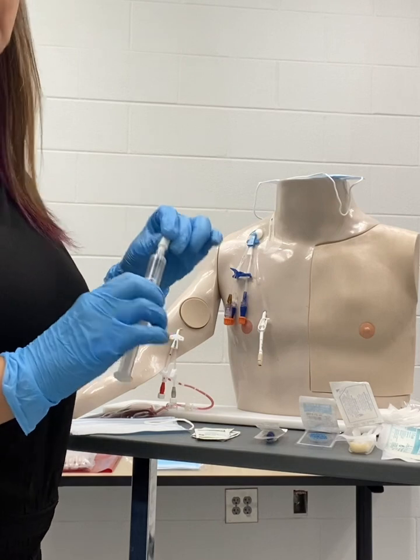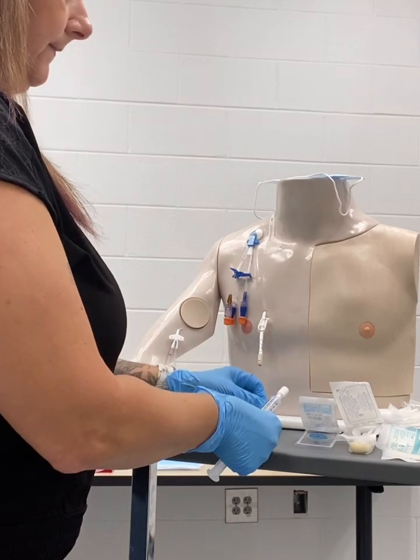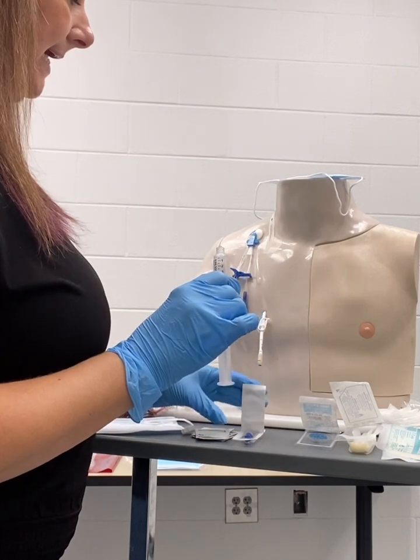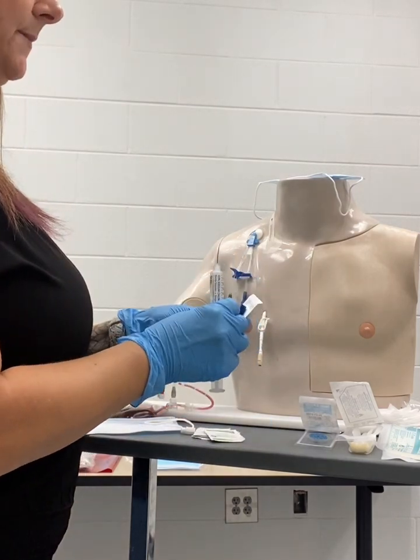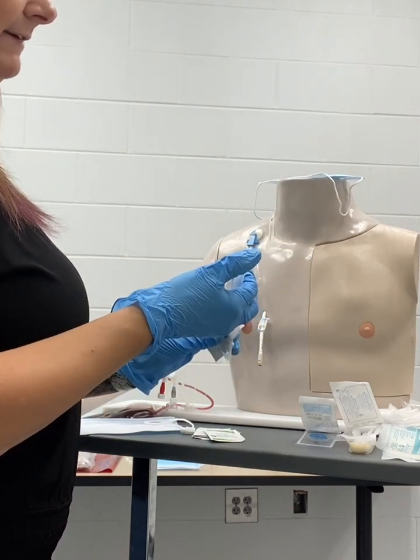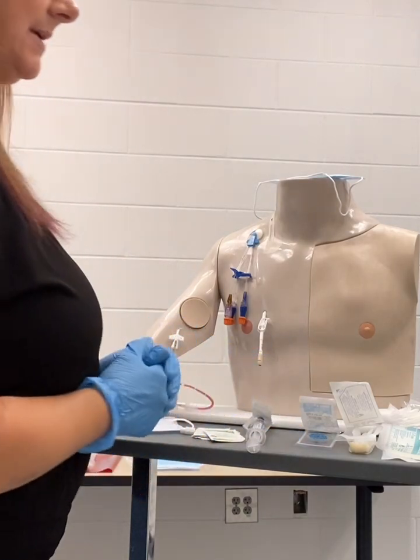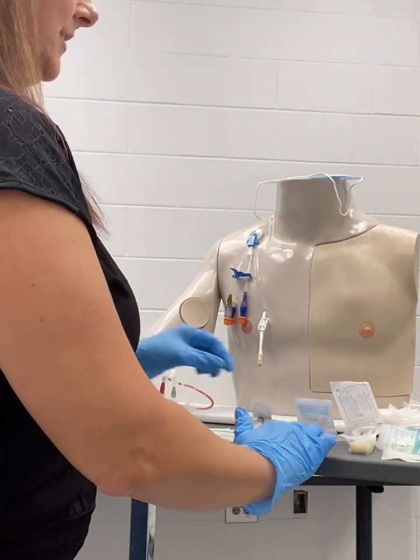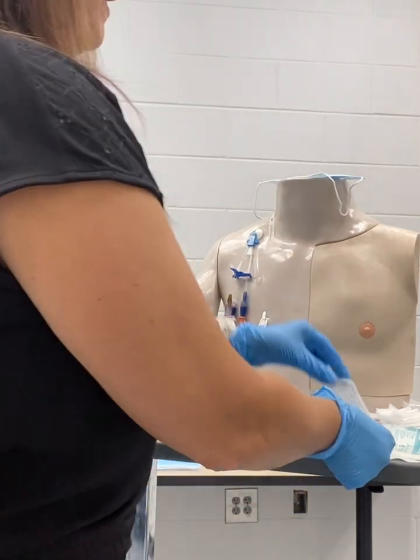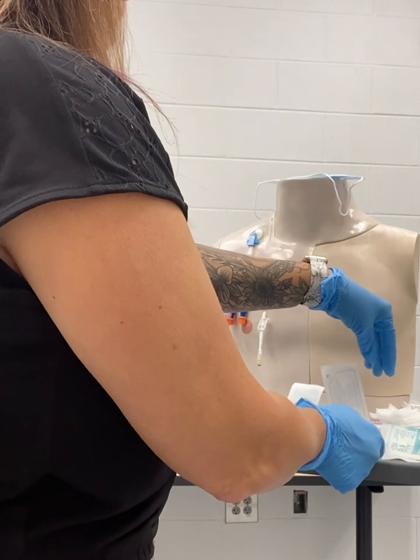I'm going to go ahead and get my caps ready. I will open my packaging for each cap, then open my normal saline, and without contaminating anything within the package, I'm going to open the cap, twist it on, and flush these to have them ready, leaving them inside the package and maintaining sterility. I'll need a new bio patch and open that as well. I'll need three chloropreps, opening these away from me and leaving those inside the package to keep them sterile.